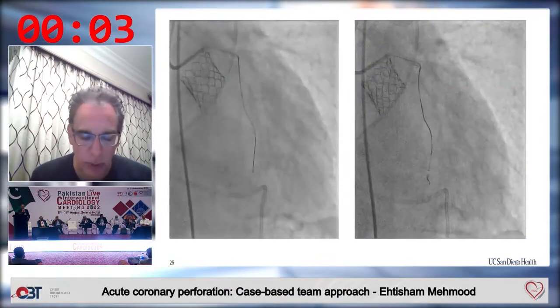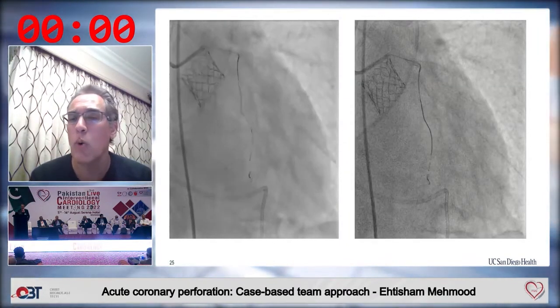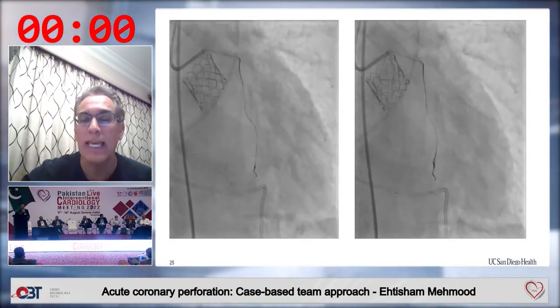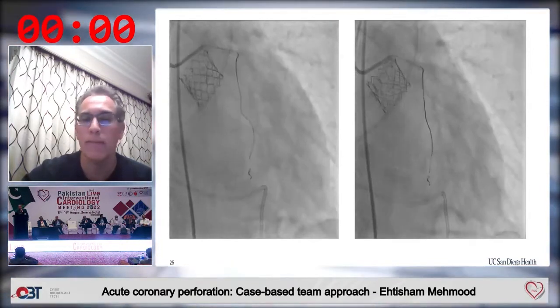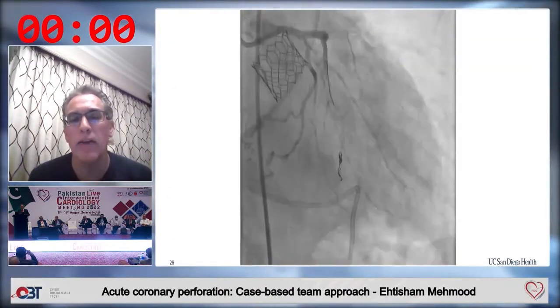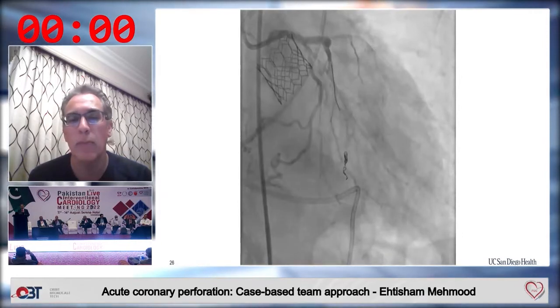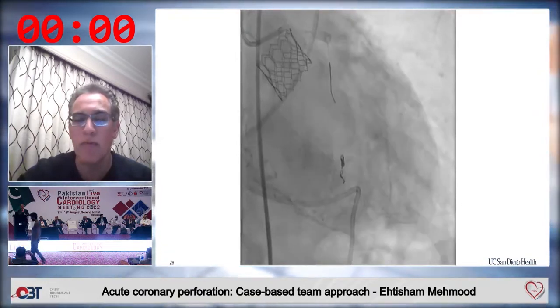Then we exchanged out the Caravel microcatheter for an over-the-wire coil delivery system. And you see here multiple coils. The Azure coils are being deployed in the distal septal perforator beyond where the two branches to the LAD are. After we coil embolized the very distal septal, you can see that the collaterals are still in place to the proximal and distal LAD, but beyond that, we have coil embolized the distal septal and that second point of perforation.